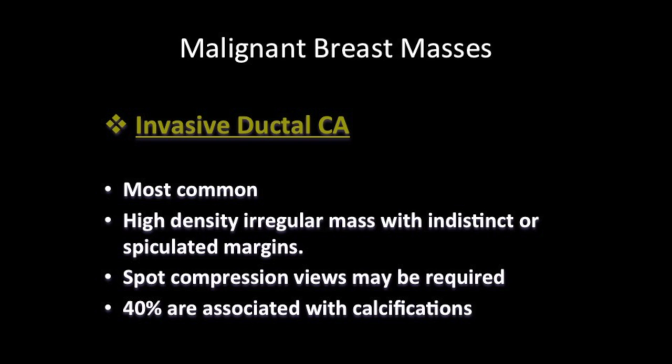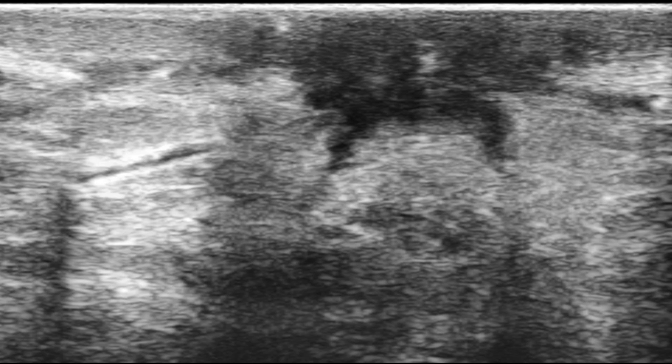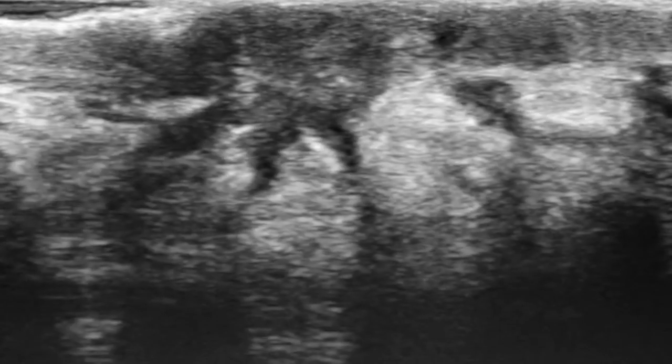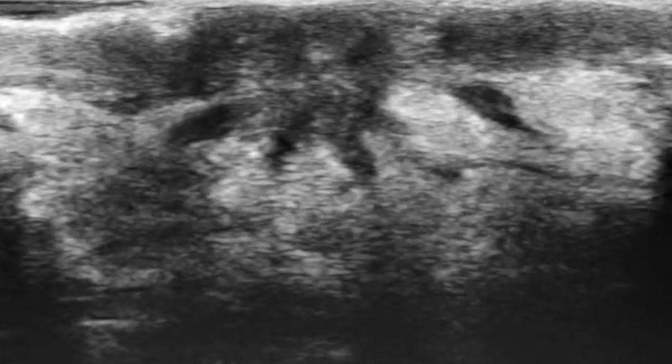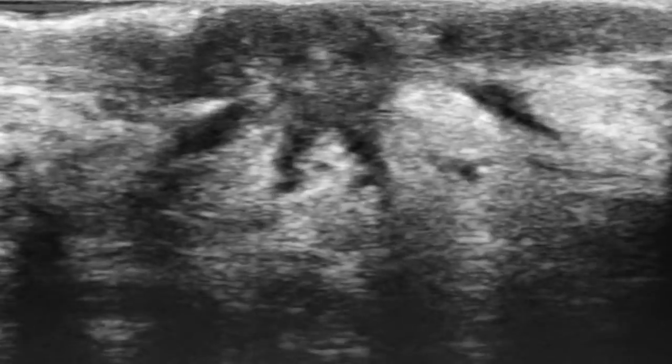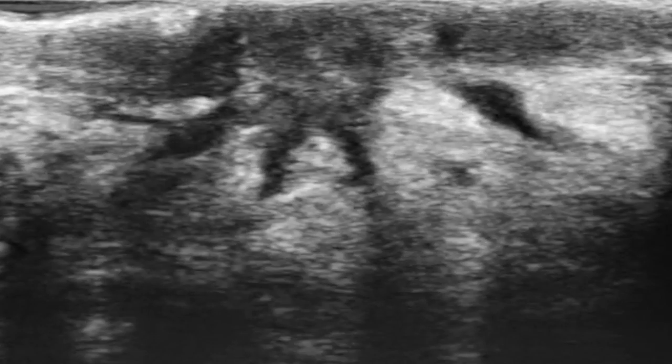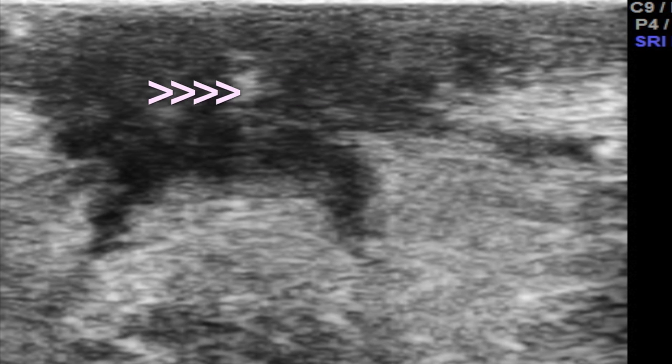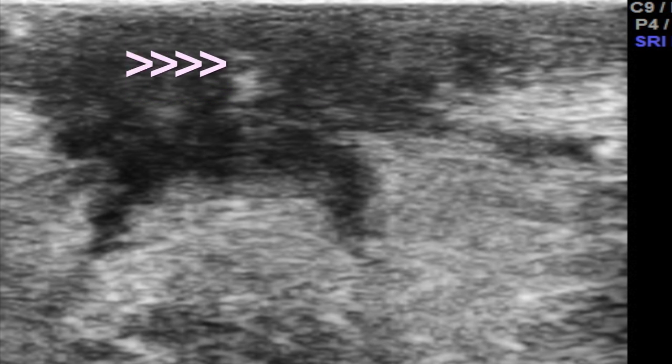Invasive ductal carcinoma is the most common type of breast malignancy. It is a high density irregular mass with indistinct or spiculated margins. Spot compression views may reveal partially indistinct margins in some cases. Forty percent of these masses are associated with calcifications.